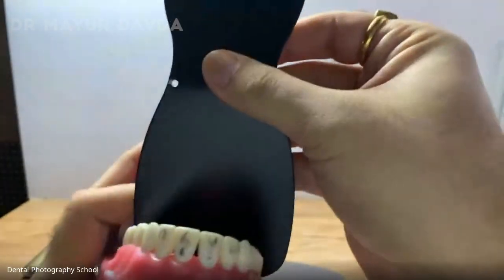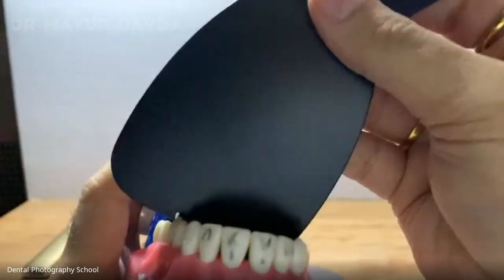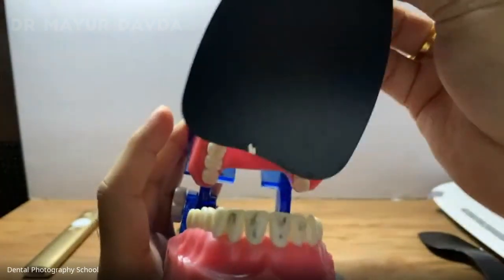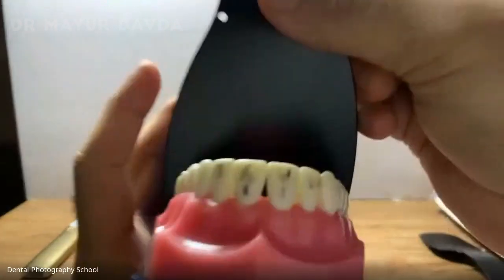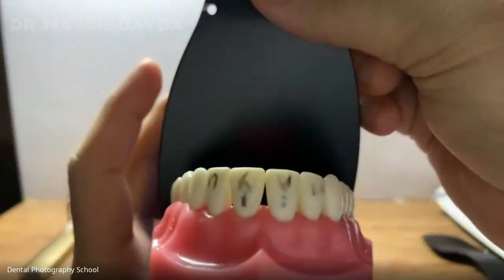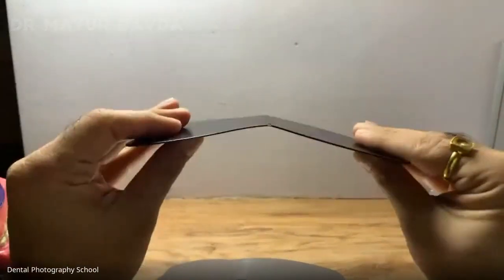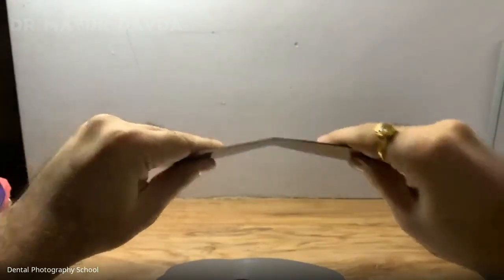And the basic rule of contrastors is don't keep it close to the teeth, otherwise textures will be seen on the contrastor. You have to keep it far from the teeth. So don't keep it like this. You have to keep it like this, far from the teeth. Okay. So with contrastors and mirrors, the general rule is they have to be away from the subject. But the most important thing is your contrastors should be contra-angled. They should never be straight, and they should be rigid. Means you should not be able to bend them.